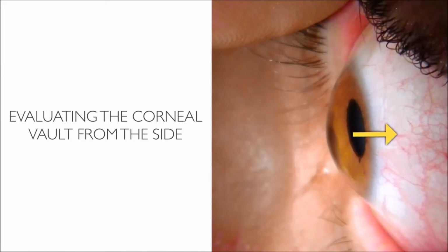And you see that this patient's sclera is not flat, but it's fairly steep. So instead of going to the low end of the set, I would go to the medium or the middle zone of the set and pick out a lens that I think would vault the cornea. Now, I always want to pick a lens that vaults the cornea. I always want to be at least 100 or 200 microns higher than what I expect, because when I put the lens on the eye, it's going to settle into the conjunctiva, and actually the sag is going to decrease.